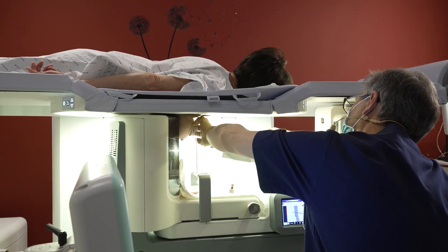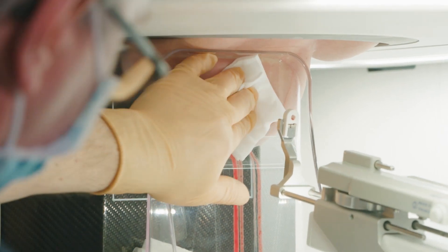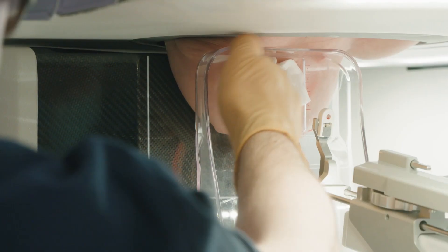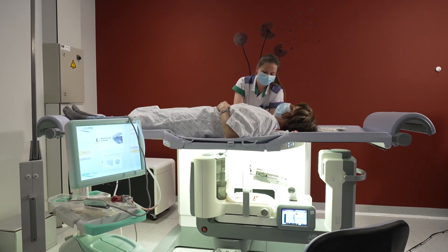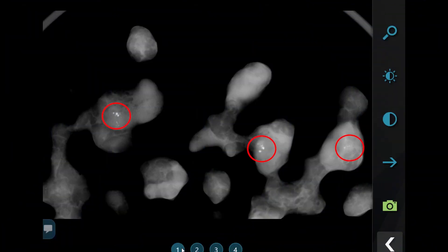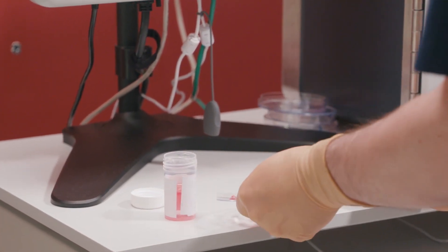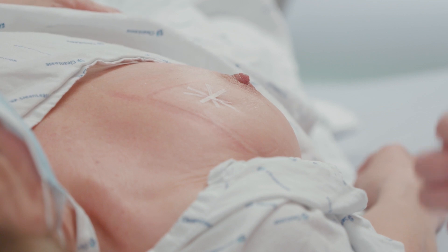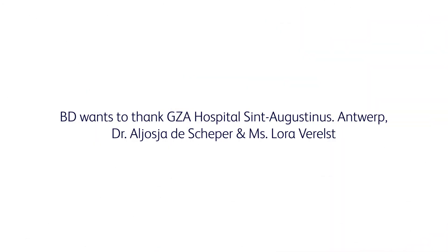To minimize migration, both the probe and tissue marker applicator are removed from the breast as one unit. The breast is locally compressed immediately. We release the pressure of the breast; it is important to maintain pressure while the patient is moving. The nurse holds pressure on the biopsy site for five more minutes. To facilitate the work of the pathologist, we separate the samples with microcalcifications. Wound closure strips are used on the breast incision site. Some final information and instructions are given to the patient.